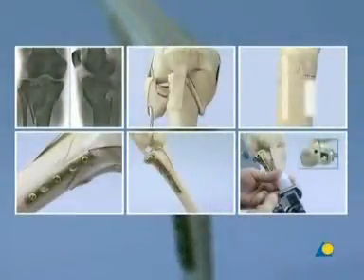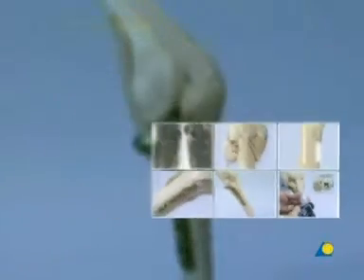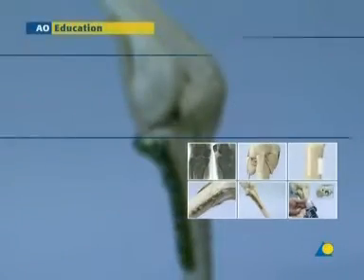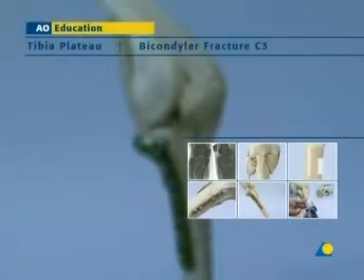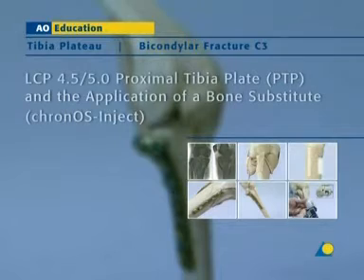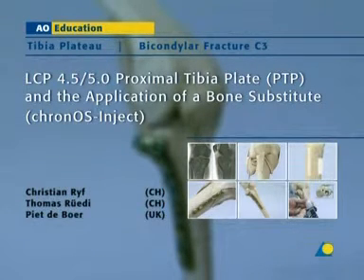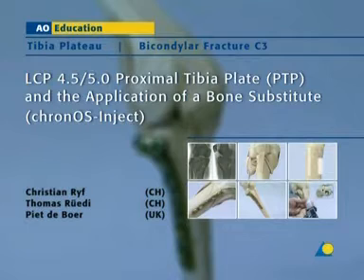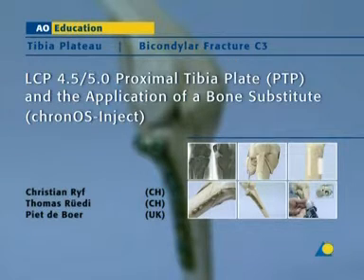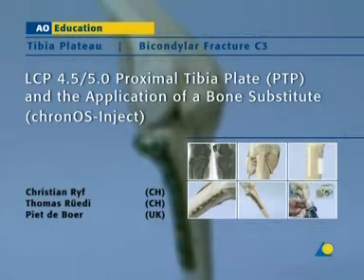Fixation of a bicondylar fracture of the tibial plateau using the LCP 4.5-5.0 proximal tibia plate, or PTP, and the application of a bone substitute — in this case, chronOS-Inject.